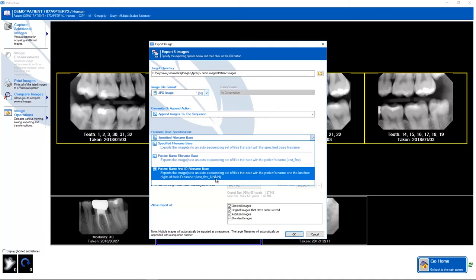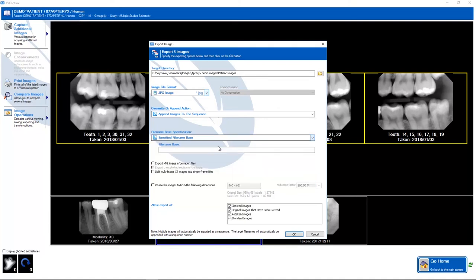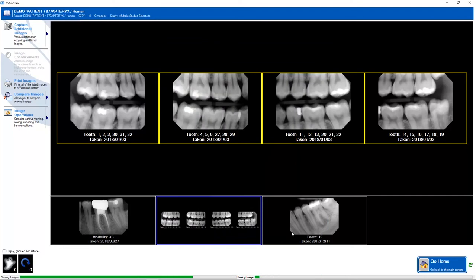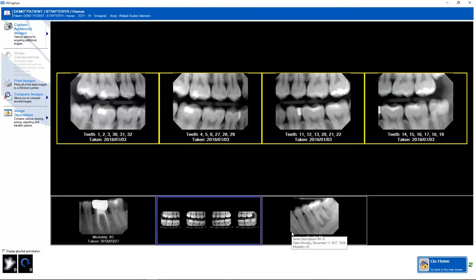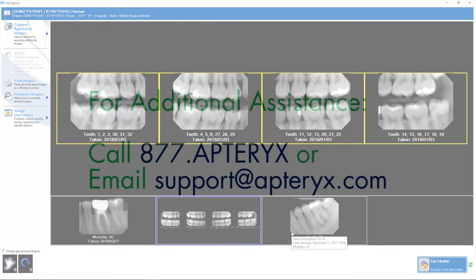If you would like to edit the name given to that file, you would choose Specified File Name Base. From there, you would just type in the file name you desire. Click OK. Those are the steps to export images from XvCapture.